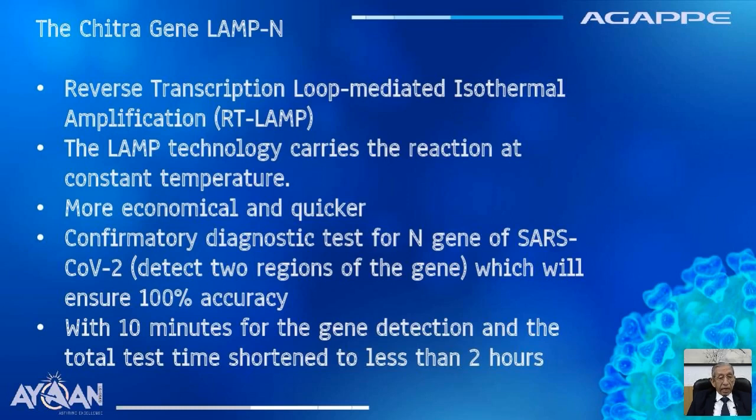The great advantage is that with this particular method, within 10 minutes, the gene detection is possible. And of course, the isolation of the gene, etc., is required. Therefore, the total time of the test will be less than 2 hours. That is a great advantage: less time, more accuracy, more economical, and the equipment requirement is also less.